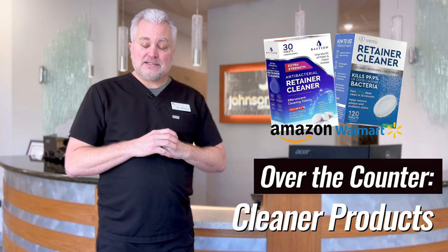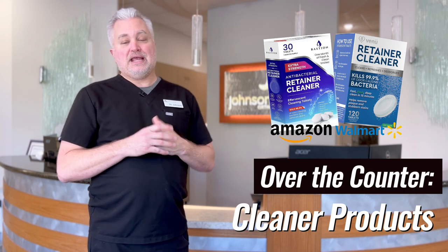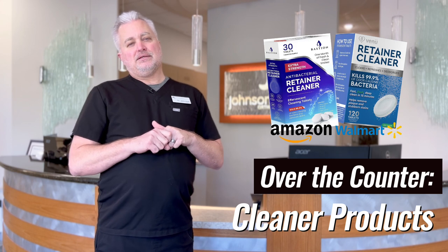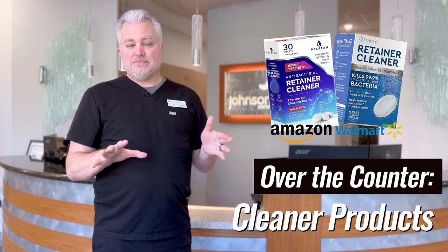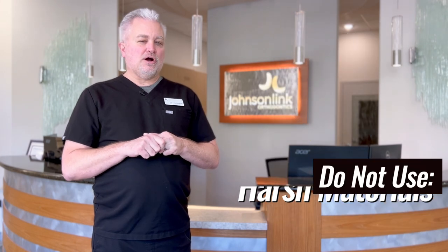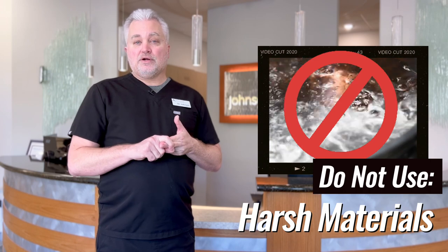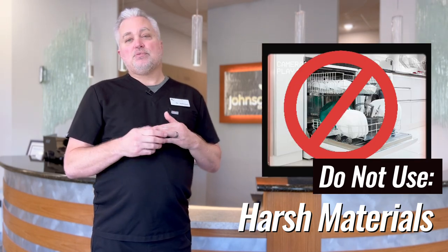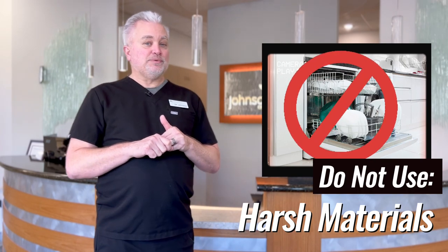There are products on the market meant to help clean your retainer, and that's totally fine — if you go to Amazon or some other place to buy a retainer cleaner product, we're totally fine with that. You should not use harsh materials on your retainer though: no bleach, no hot water — at least not boiling hot water; you can use warm water from the sink.